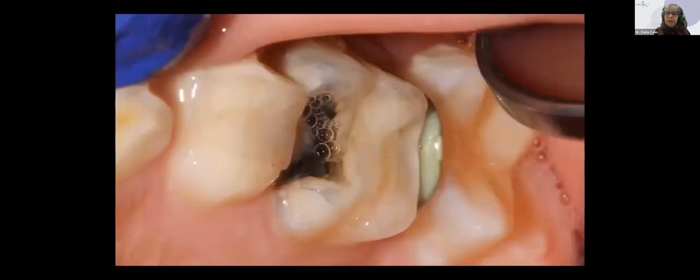I have treated that caries with silver. What you see posterior to that second primary molar is an orthodontic separator, which in this slide has already been in place now for a week or so to make some space. I've got space on the mesial because I've got all that decay. This child comes into practice after the silver has been placed, after the separator has been in place.